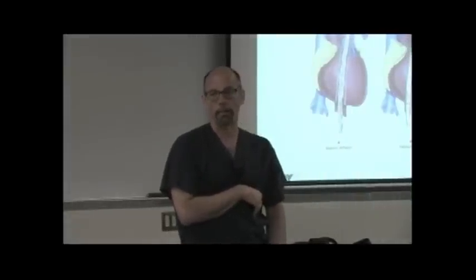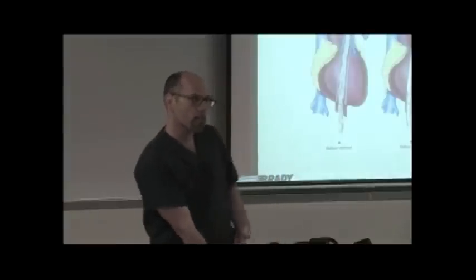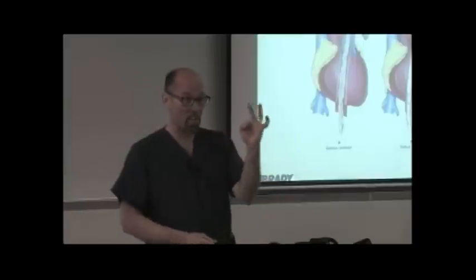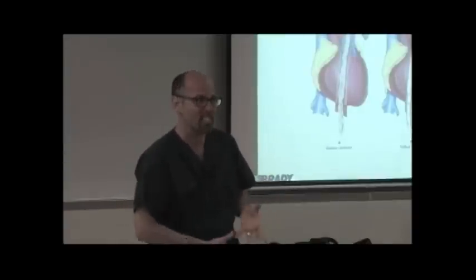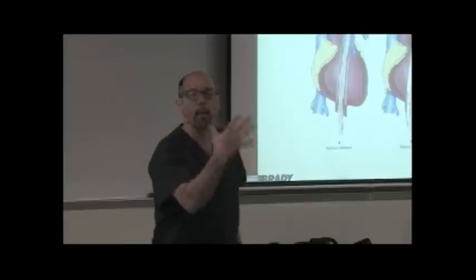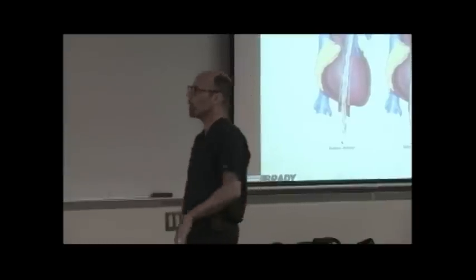Complication rate. Having a big, huge catheter like that in the femoral artery. Clots, vascular compromise distal to the catheter. That's why you can't sit them up. It can move, and it takes up a huge portion of the femoral artery. So if I've got femoral artery peripheral vascular disease, I've seen patients lose legs from having had a balloon pump in. Infection is another big one. Yep. It's in the groin. You better believe it. So that's sort of the limiting factor.